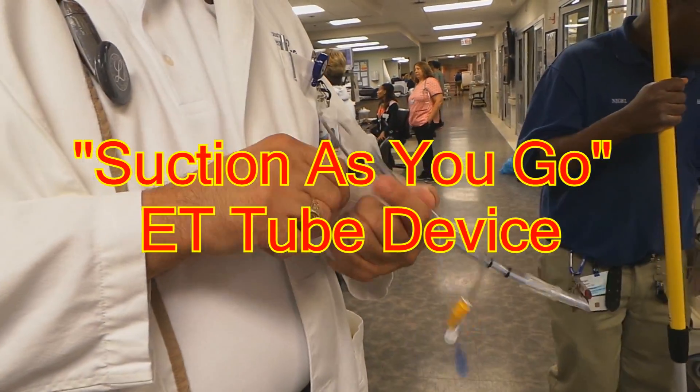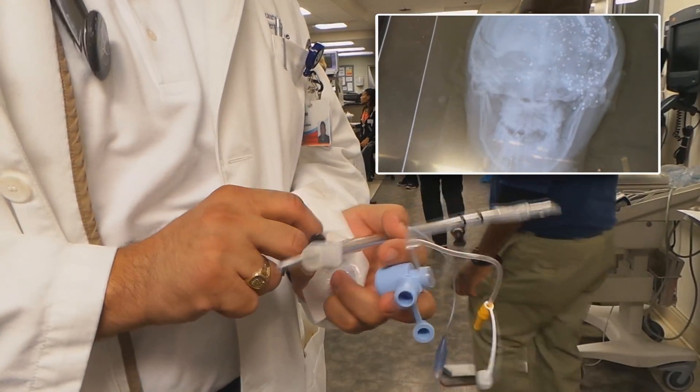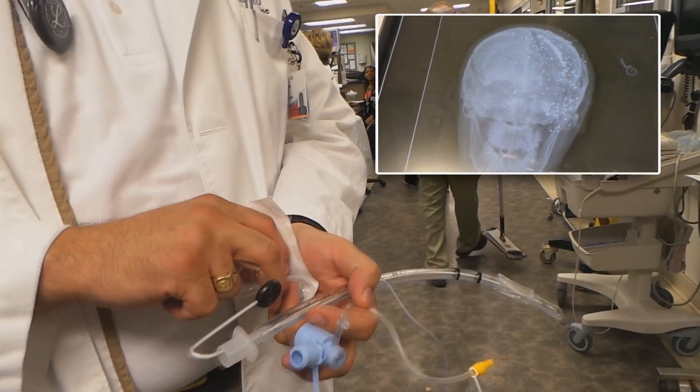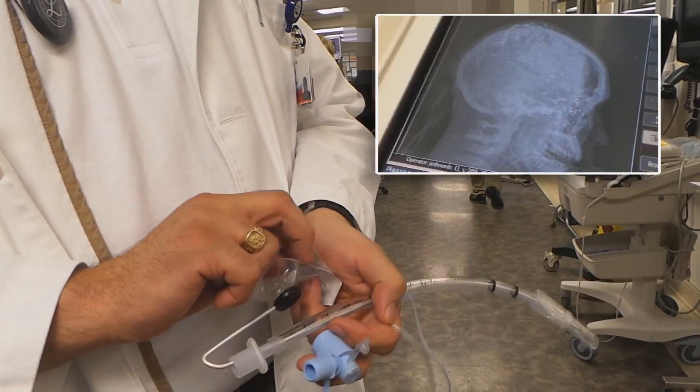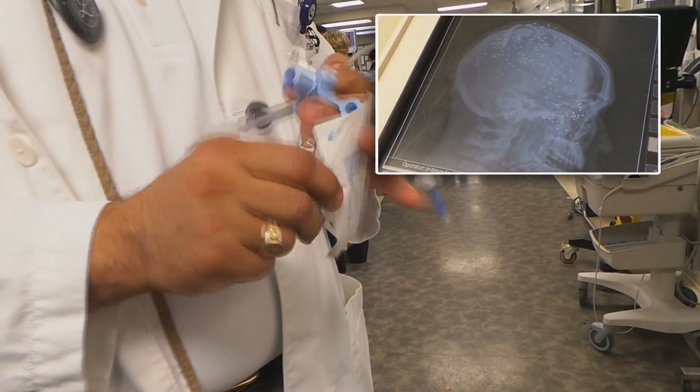So this is in context — we just had a patient that had a GSW to the face, a fatal wound, but he was massively bleeding from the face. We were suspecting that he was going to have massive blood in the airway. He did not, but we were expecting him to have lots of blood in the airway.